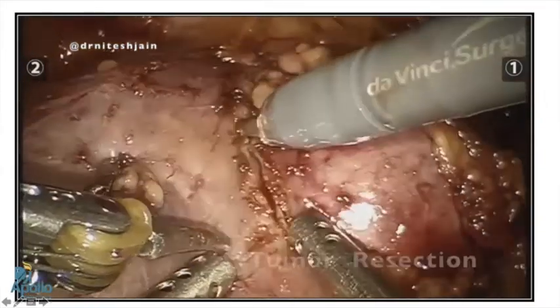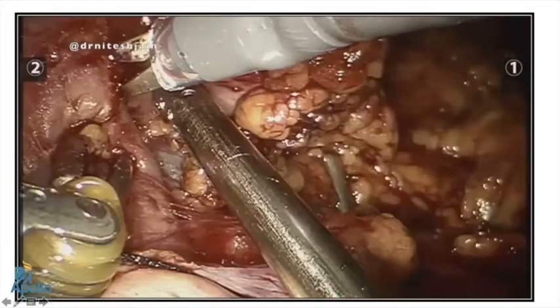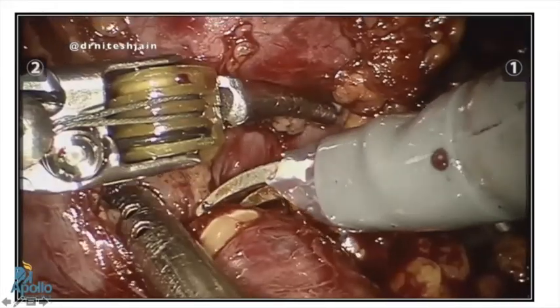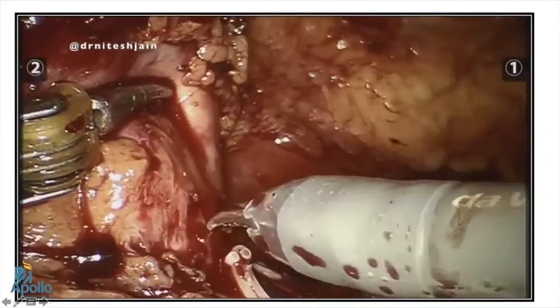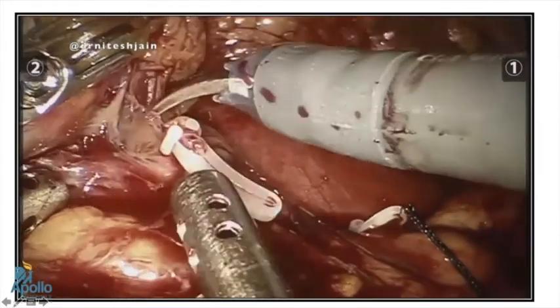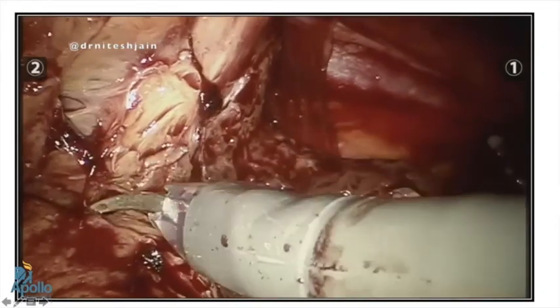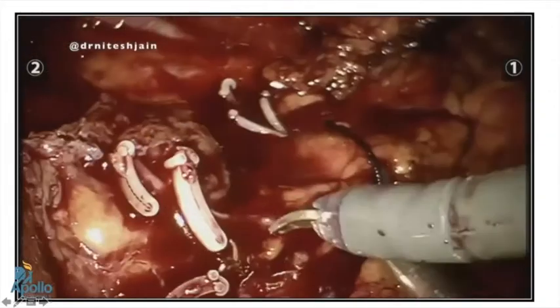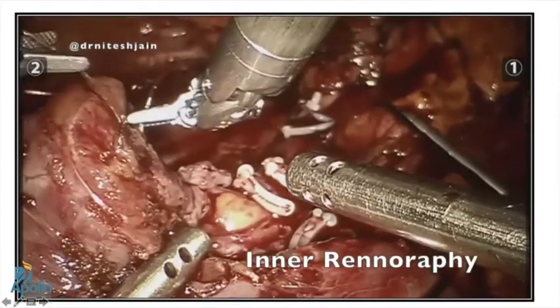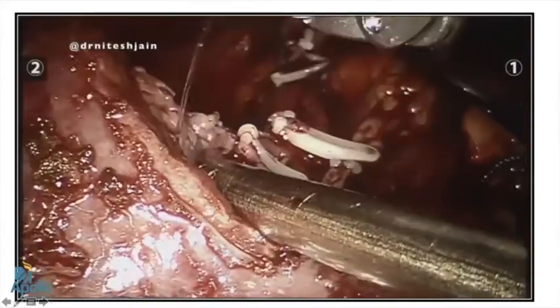Drop-in ultrasound plays a very important role in marking the tumor boundaries, which can then be scored all around. Since it is a hilar tumor, both artery and vein are clamped. The tumor is cut using scissors, starting from the closer margin — the margin nearest to you. Constant traction with one hand on the tumor helps visualize the plane. Near the sinus fat, the tumor can be peeled as in enucleation. Any vessels entering the tumor are individually clipped and cut. The inner renorrhaphy is then done using 2-0 Stratafix, with any open PCS sutured individually.